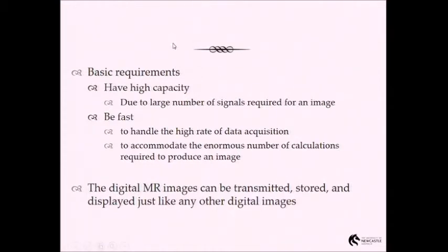Where this becomes an issue is I was at a kids' hospital where they got an upgrade to their scanner that allowed them to make these images in a very rapid fashion. So they're doing kids with GAs. They ran this new sequence that they were given on their old scanner, and it took 20 minutes to reconstruct. So you can't keep a child asleep for 20 minutes under GA just because you're not sure if the images work.